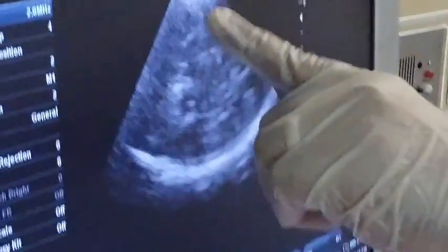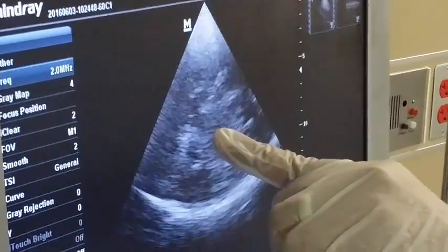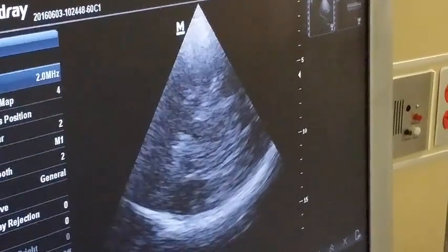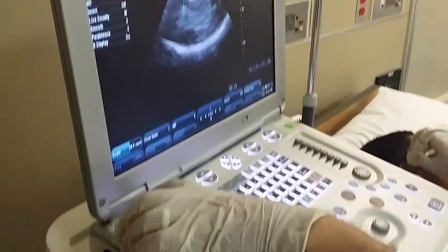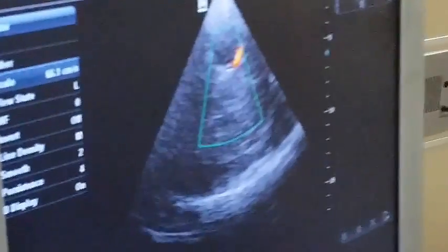I will try to get the Mickey Mouse appearance, which is the brain stem, to appear in the center of the screen. This is a very important landmark. Once you get it, you start to fire the color flow and adjust the scale to increase it to around 50 to 60.